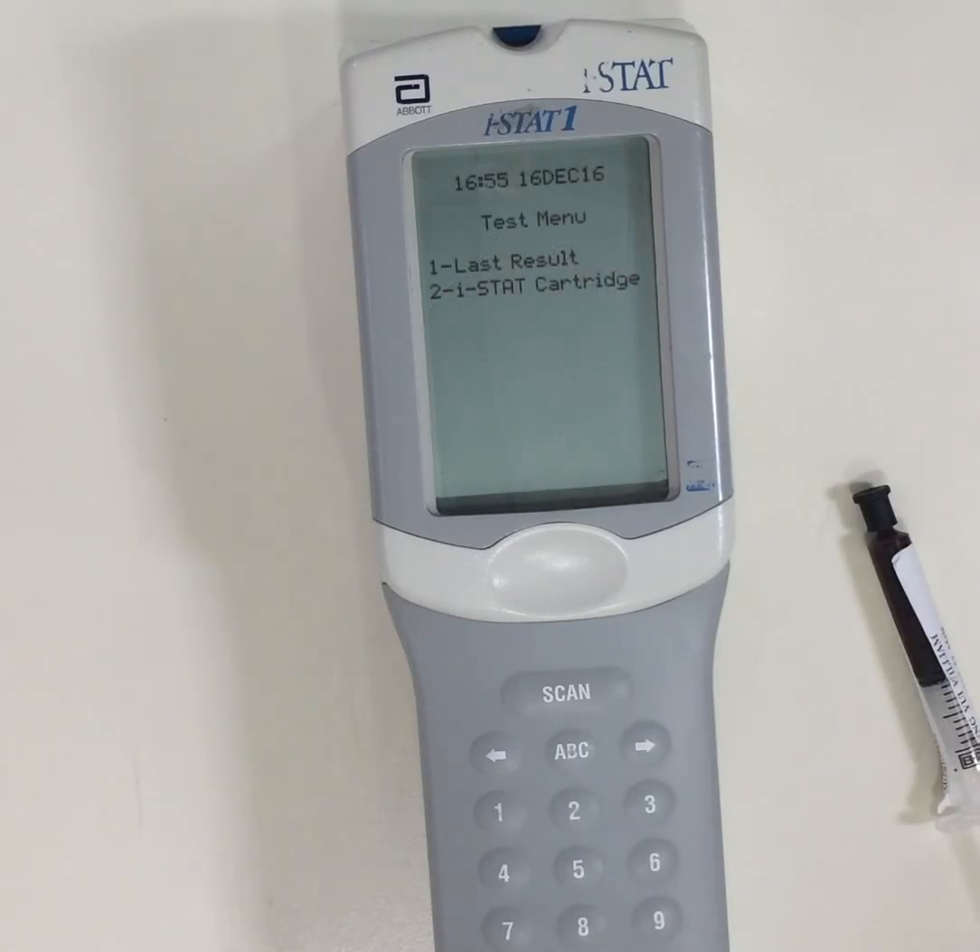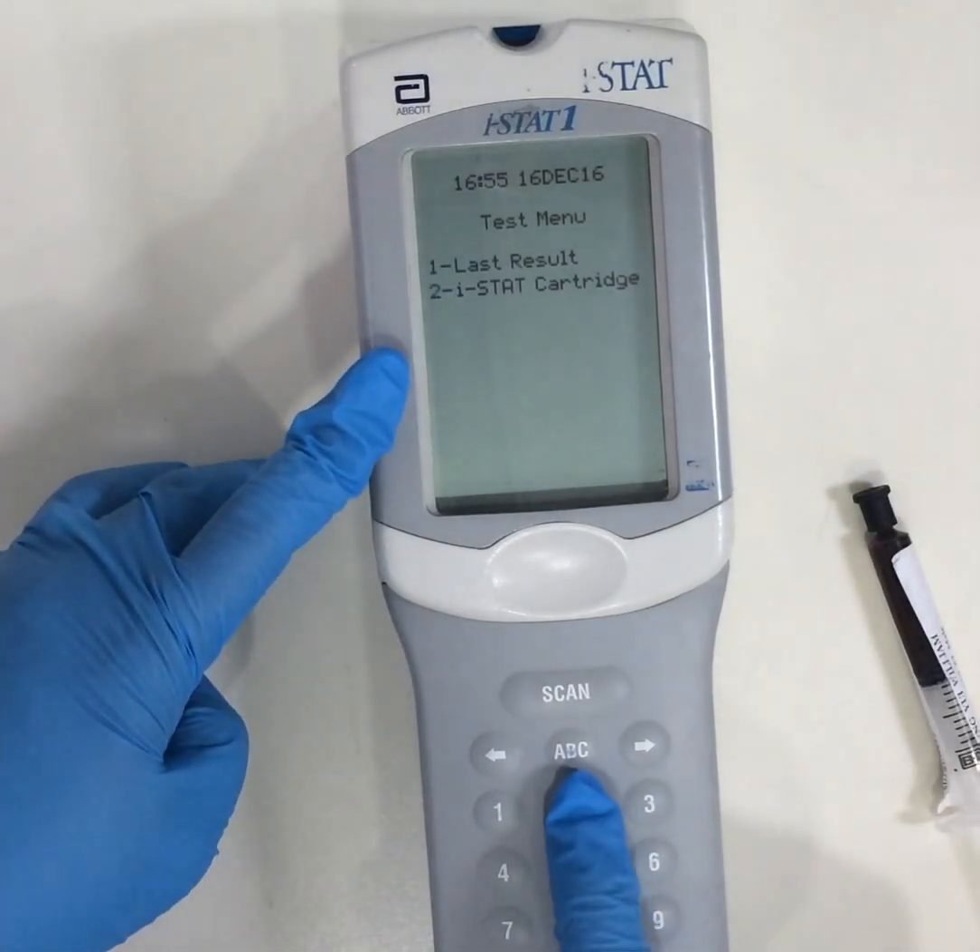Here under the test menu, you have one last result or two iSTAT cartridge options. Since we will be using a new cartridge, we would select two.